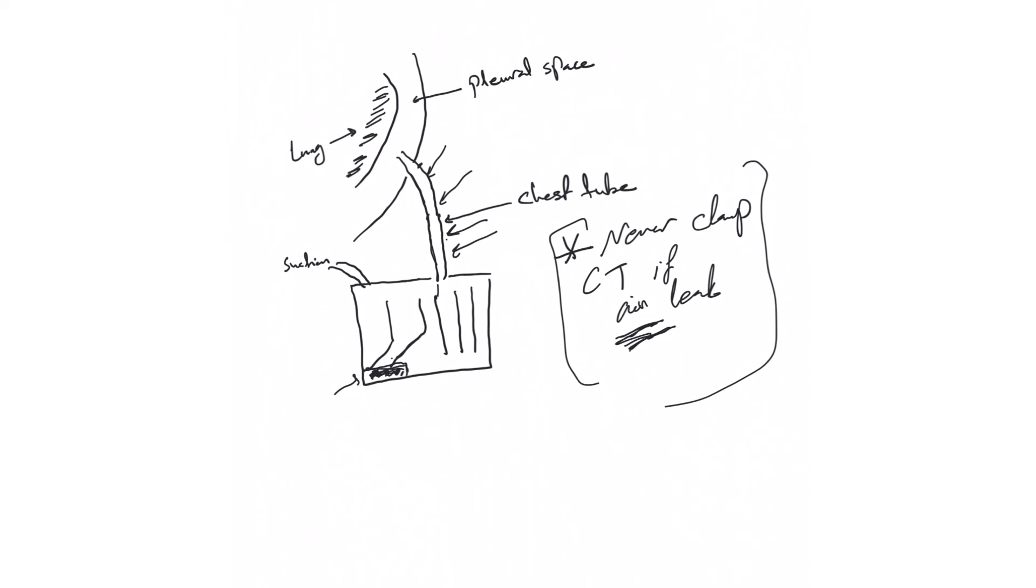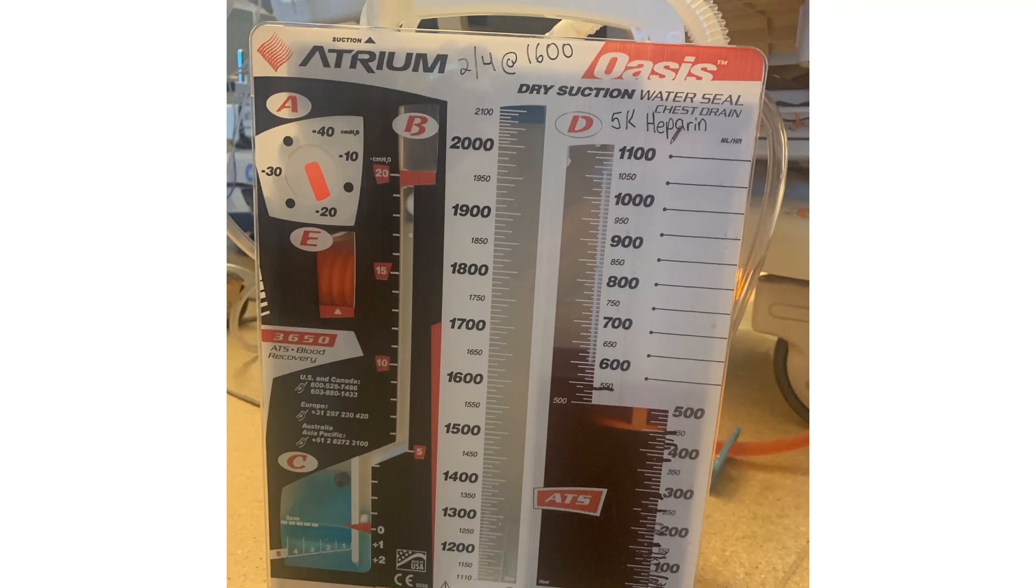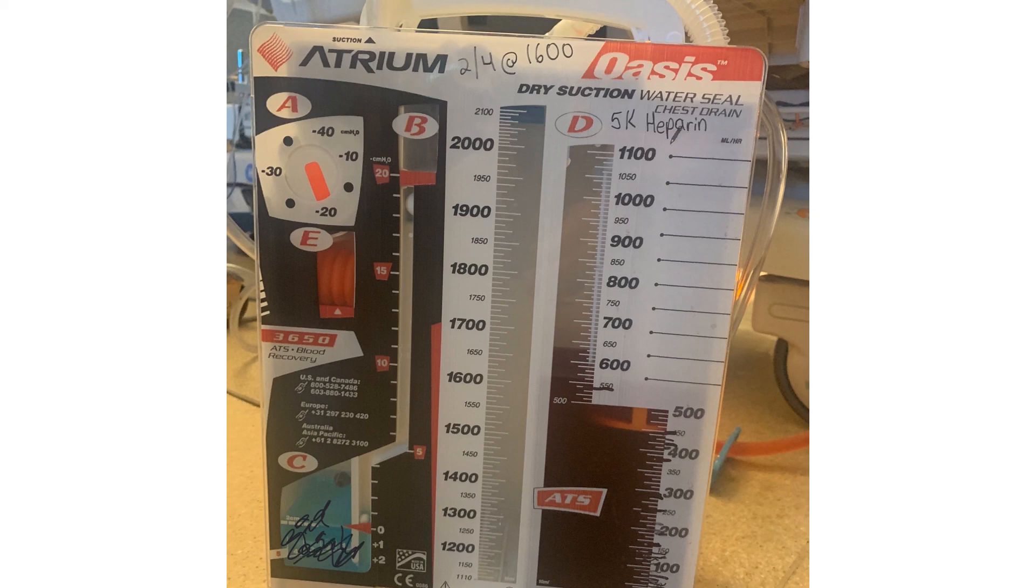This is the real chest tube. The bubbles you will see—the bubbles right here in this area. See bubbling? That means there is air leak and then you need to figure out where it's coming from.